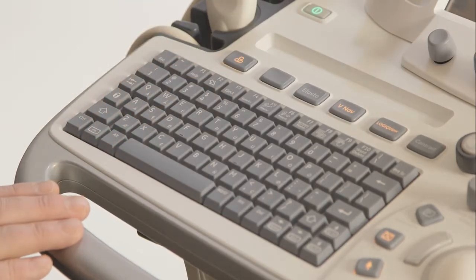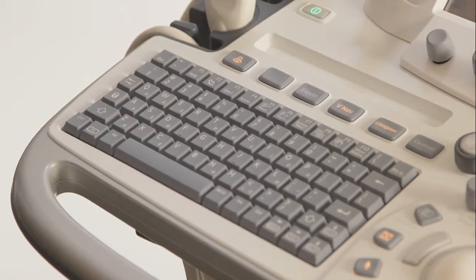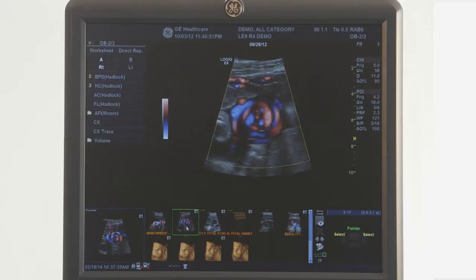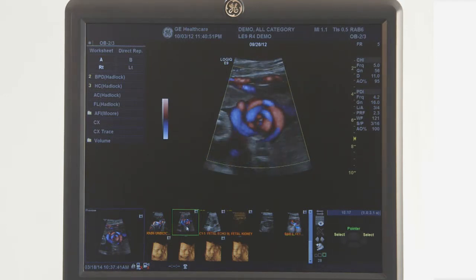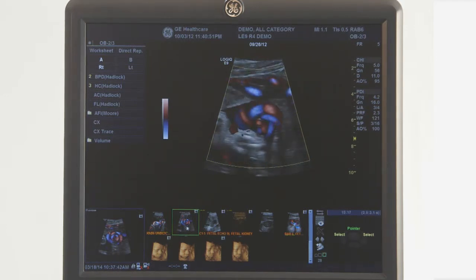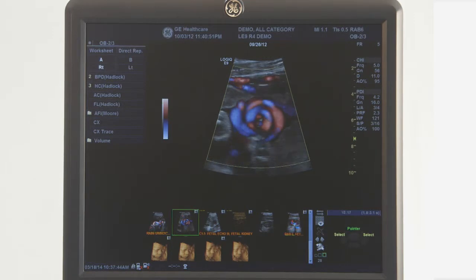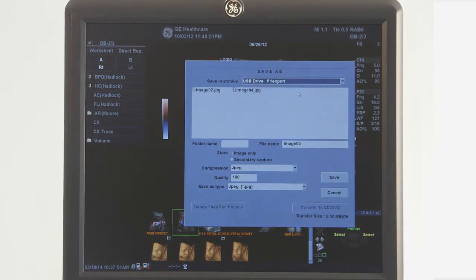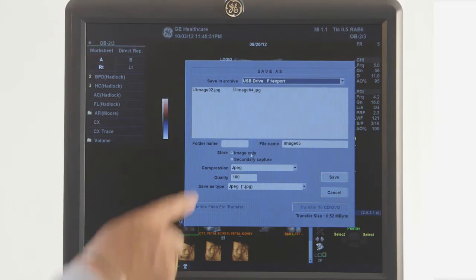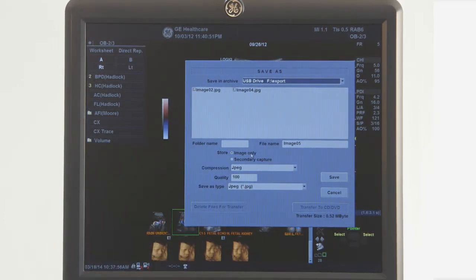Then you can check the disk on a PC and confirm if the images are there. To save images with patient information, recall the study and choose an image from the clipboard. In the lower right side of the monitor, choose the Save As icon. At the top of the Save As window, choose the correct destination. If you do not want the patient or institution information on the image, choose Image Only.